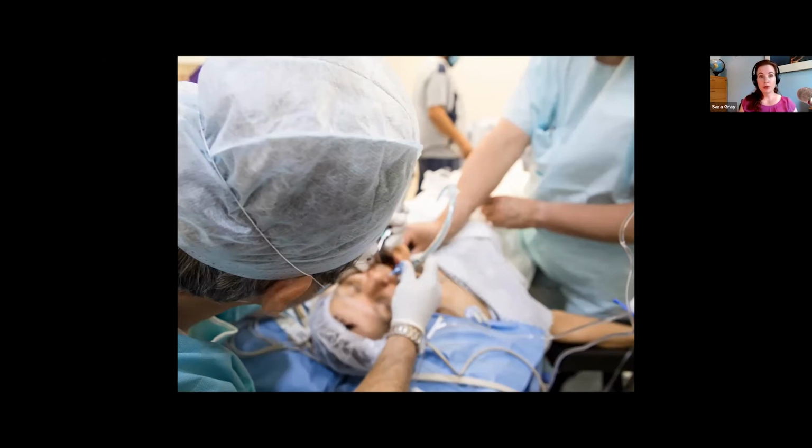Or if you want to measure this on the ventilator, you can look at, are they losing tidal volume? And you're usually looking for about a loss of 25%. Or occasionally you can listen with a stethoscope for a subtle air leak over the neck. But you want to be sure that air is moving around the endotracheal tube, because this is a key indicator that your airway is not overwhelmingly swollen.